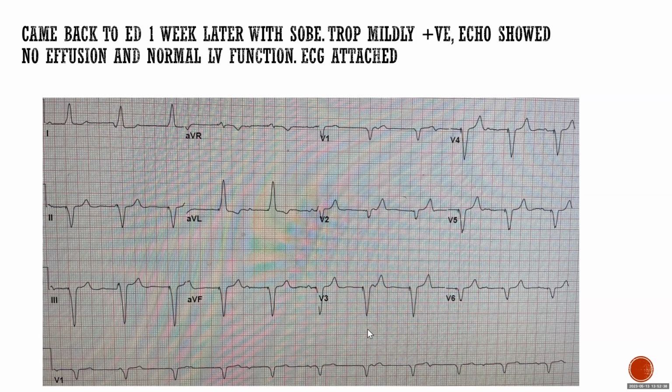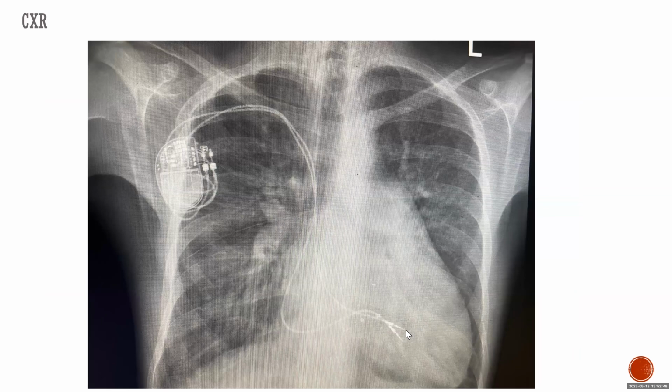And when you do the X-ray, the atrial lead dislodged and dropped down to the ventricle. Yeah, AV delay not constant. Bilal is asking what's happening in the second beat.